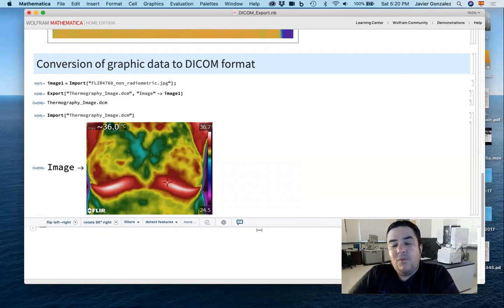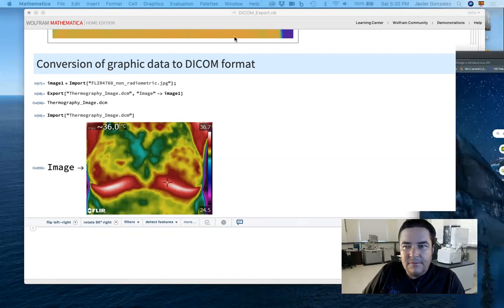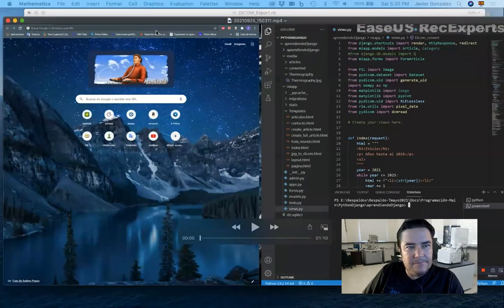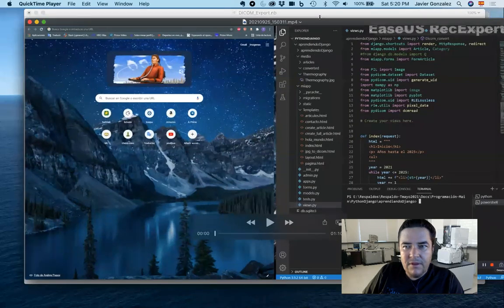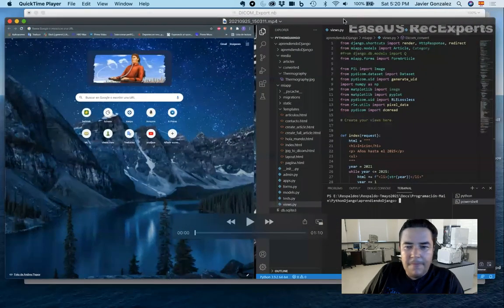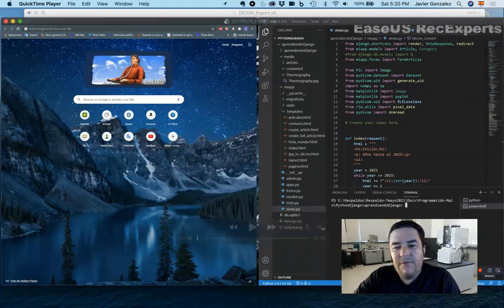Since I wanted to make something more friendly to people who are not experts in image processing, I started working on an interface to do this as a website. So I did a video right here of this same proof of concept, but with a web interface. Everything that I showed you before in Mathematica, I did it again in Python.